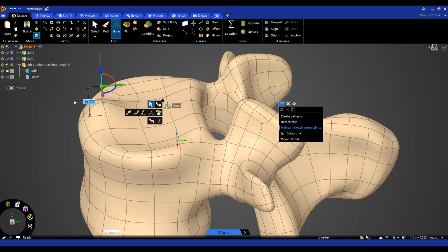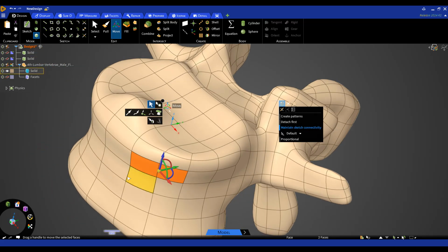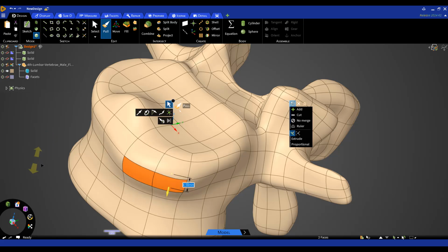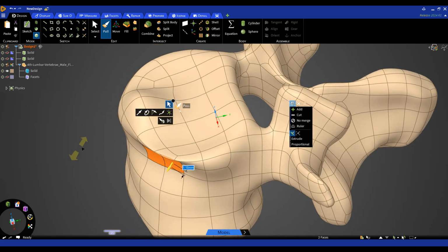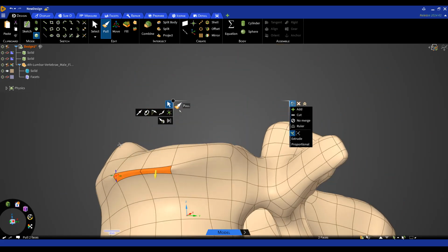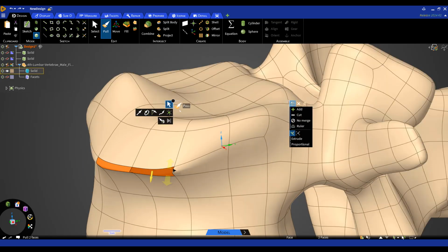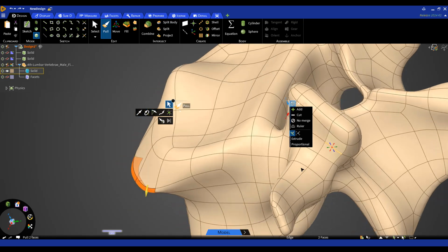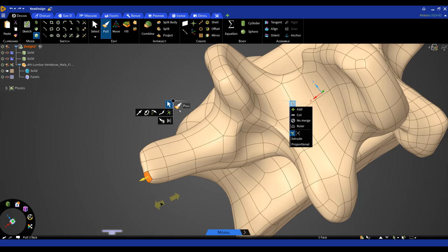So I can bring it up. I can rotate it and say pull it in this direction. I can grab any surface and I can pull normal to it, or I can pull into it, make it concave or convex, or pinching the part here. I can select specific points here, and maybe I'll say, hey, let's make this a little bit more protrudy, like that.